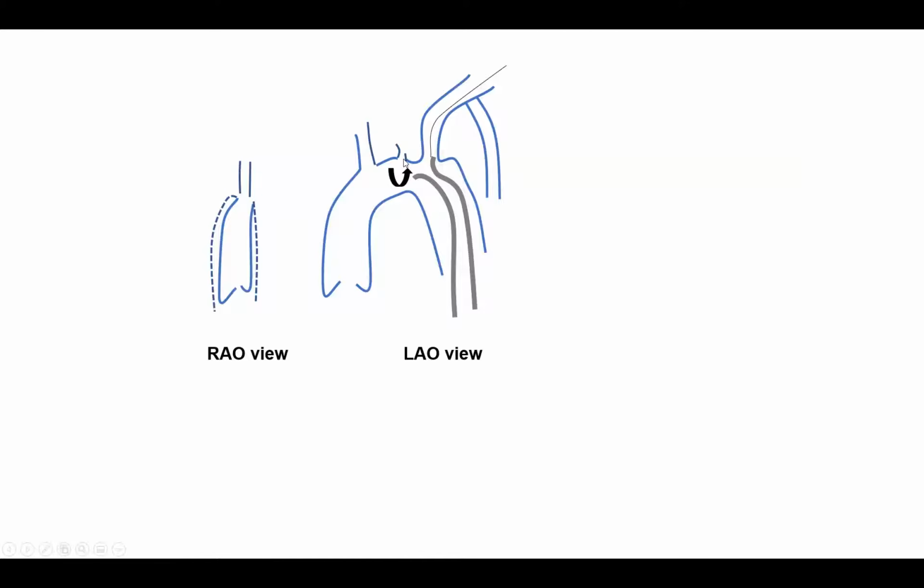So what do you do in this case? One standard technique is that you reverse the torque. You clockwise torque it to make it fall down. Then you pull again and counterclock to hook the left subclavian. So you reverse it, make it fall down, then you pull with a counterclock to hit the left subclavian.